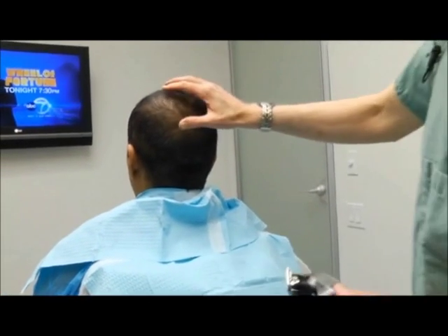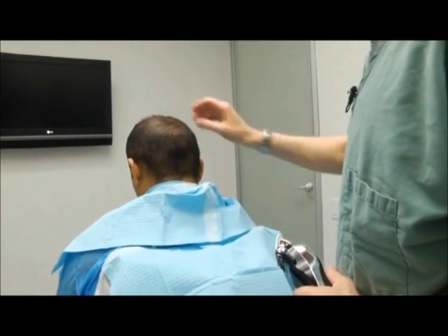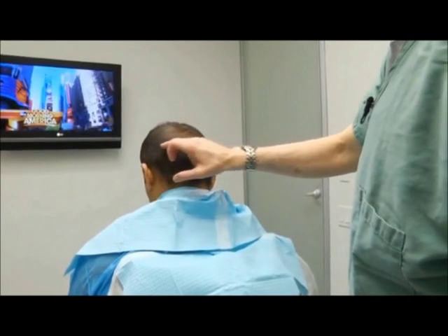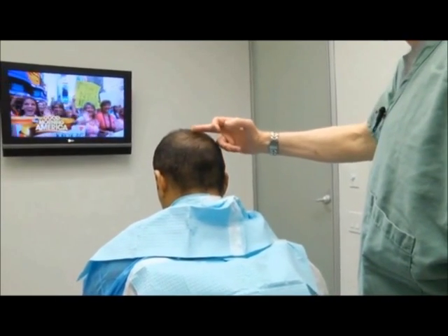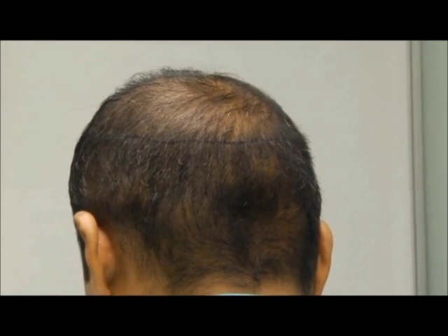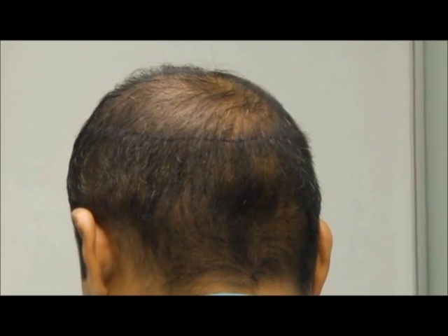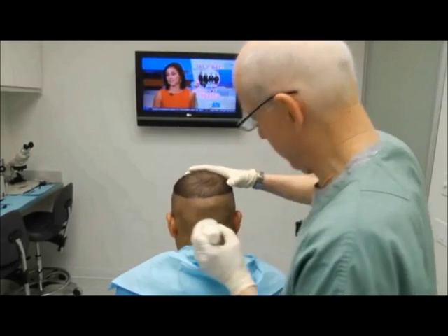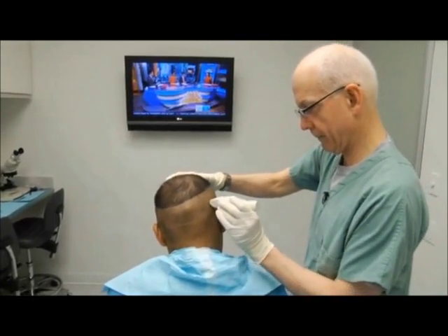The important thing in follicular unit extraction is to delineate the permanent zone. We can see the area that separates the permanent zone from the area that's balding. We're going to prep this area. Normally we shave the scalp to about one millimeter, so we're going to use regular clippers just to delineate the area.